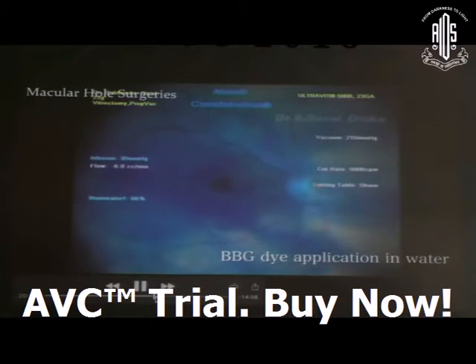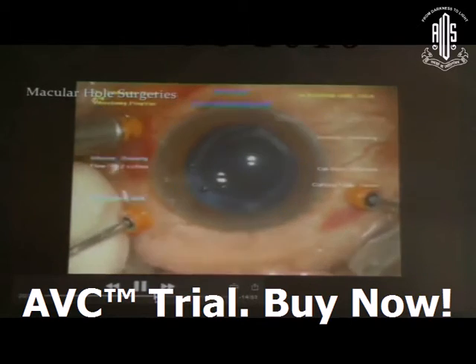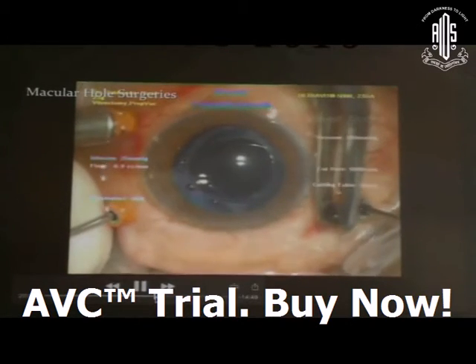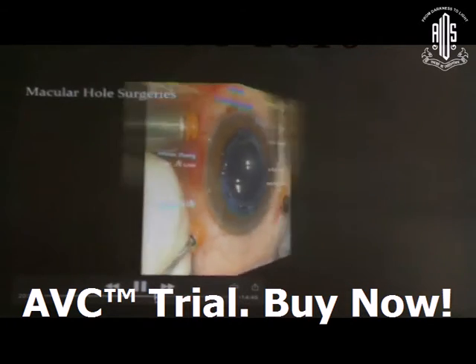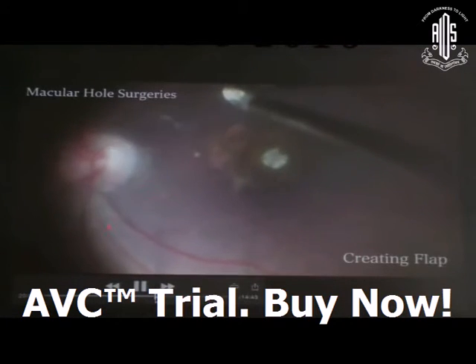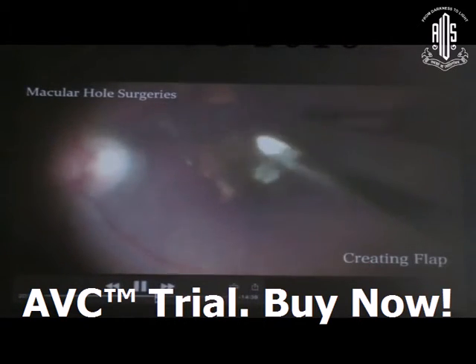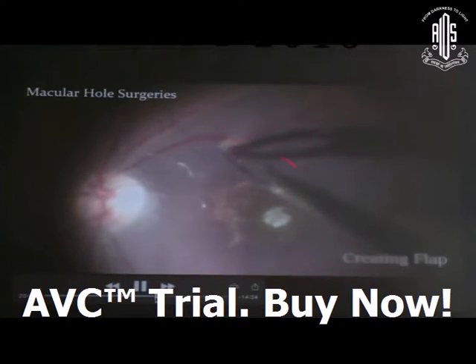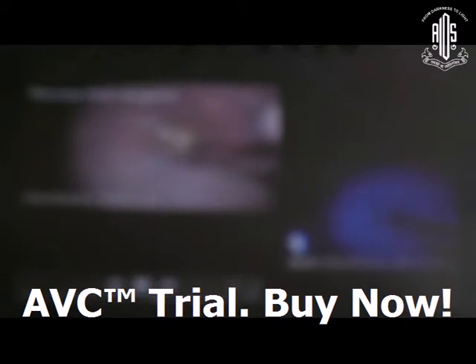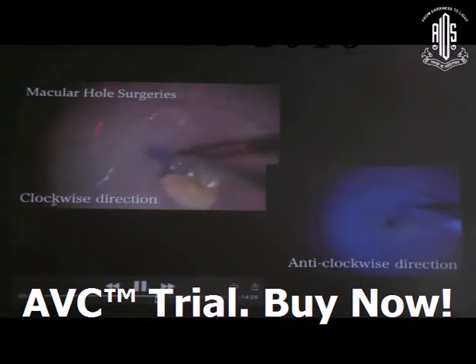Here I am applying BBG in water — wait two to three minutes for adequate ILM staining. After staining the ILM properly, raising the flap is the most important step. You can create the flap at the most convenient area for the surgeon — inferonasal area or inferotemporal area.